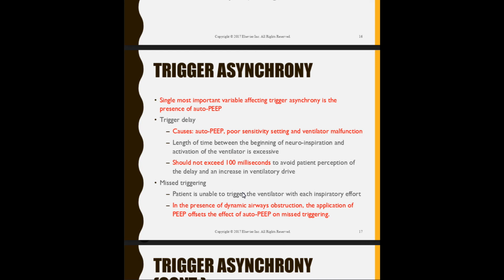I want you to understand that, because I don't want you to sit there like, well, if patients have increased work of breathing, can I just match the PEEP with the Auto-Peep? No. Remember, we talked about this. To correct Auto-Peep and an increased work of breathing, we set the trigger 1 centimeter water pressure. Let me think. Is that what we're dealing with?